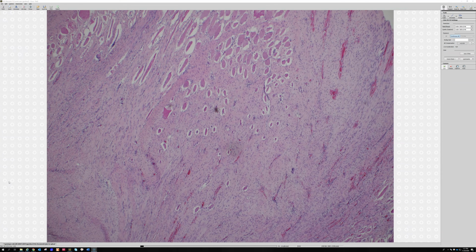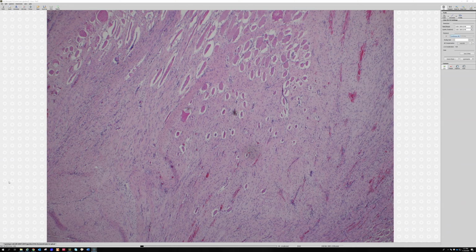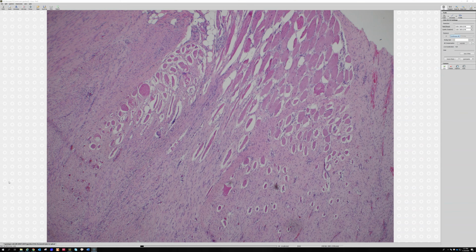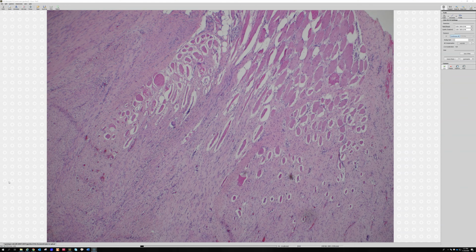And when we're really lucky, we'll see on the sample this entrapment of skeletal muscle. So this tumor is locally aggressive. It's an infiltrative tumor, but it does not have metastatic potential by our current understanding. But it really can cause some problems because it can grow into normal structures. It has a high rate of recurrence when it's excised. And when I was in training, there was still a tendency to do wide local excision on these. But over the past 10 years or so, I've seen this trend in a lot of places. They choose to not excise them, and they treat them with different types of medical therapies like tyrosine kinase inhibitors, and sometimes can really stabilize or even shrink the tumors down.